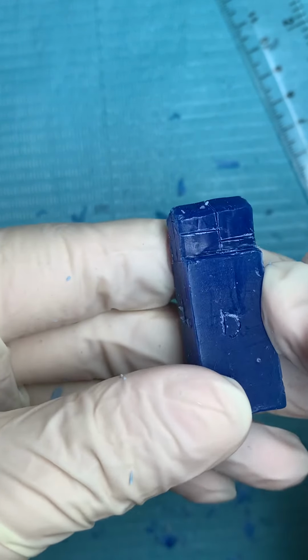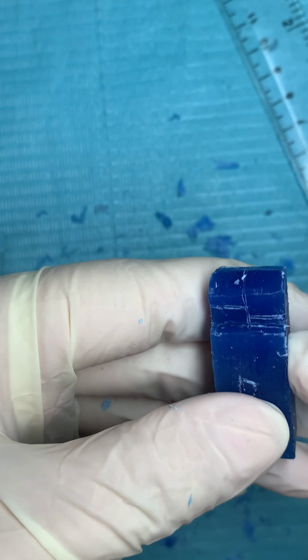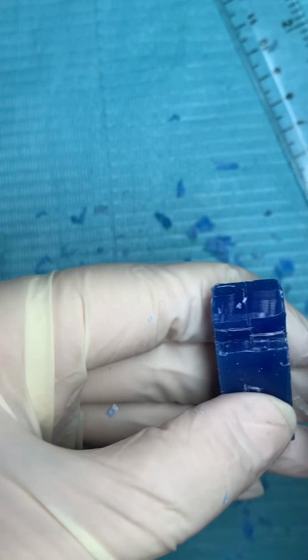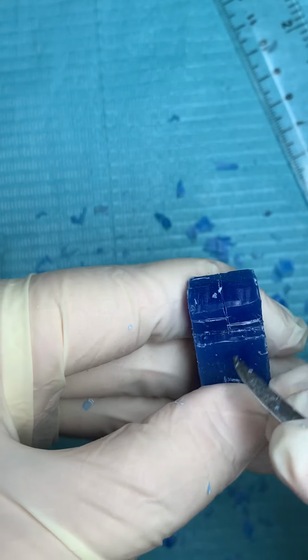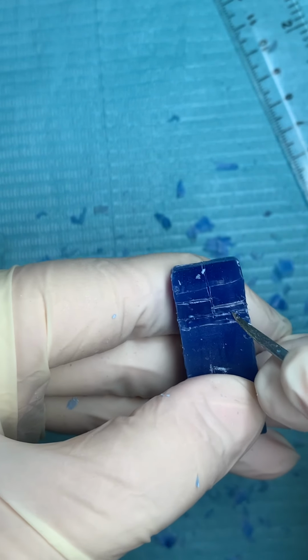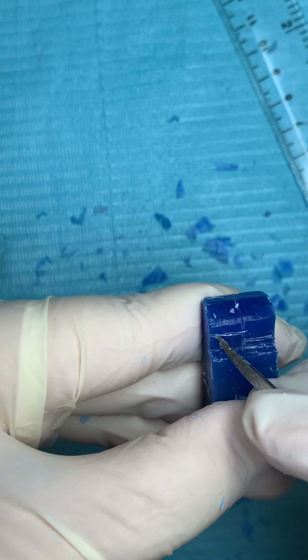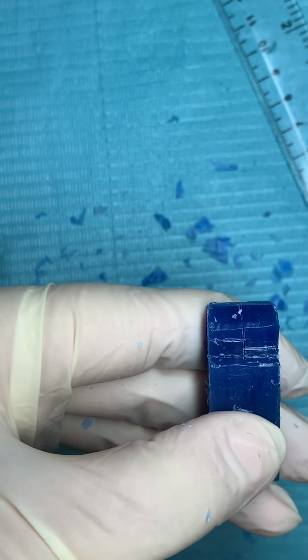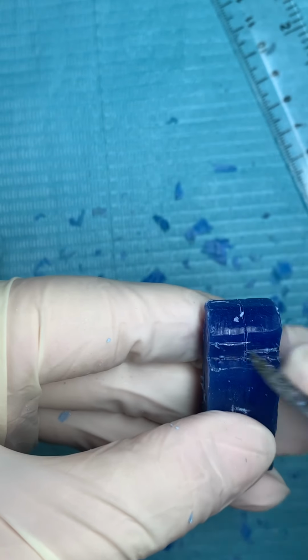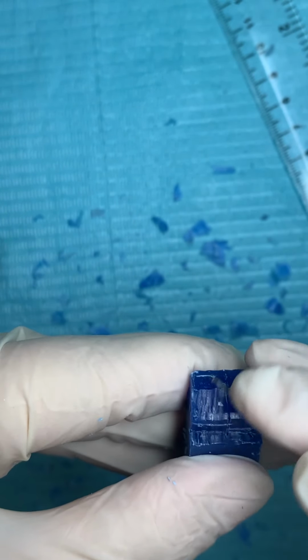Okay, then measure your buccolingual dimension. Your buccolingual dimension here I have at the neck, it will be 3.5, measured by the ruler, of course, 3.5 and 3.5. Here it will be about 4 and 4, okay, because my buccolingual dimension is greater than the mesiodistal dimension, so it will be here 3.5, 3.5, 4 and 4. Here I will find my first step of difference.